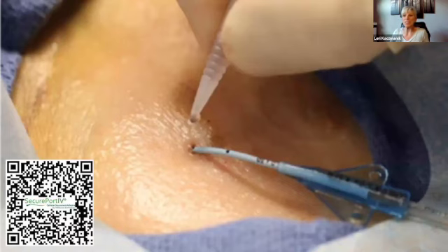And the other thing too is, if you have a wound care clinician in your hospital, go speak with them. I'm betting that they use some different formulation of cyanoacrylate in some of the wound care that they already do, because it is a very effective barrier. So you can think of it as, if you're using tissue adhesive first on the skin and then putting your dressing on, you're putting the dressing on top of that glue layer as opposed to on top of the skin. So it really does protect the skin and works very well, even in our little kiddos, really well tolerated on their skin.